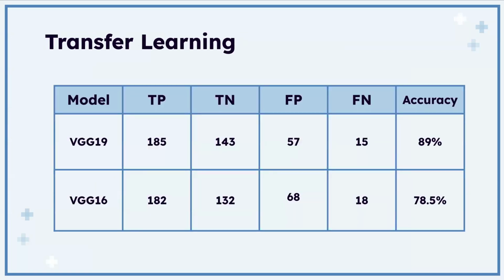So now looking at the table of results, our best performing model was VGG19. It had a strong balance of catching the most pneumonia cases and not flagging too many healthy people. It also had a relatively low false negative, which is really important in medicine. And VGG16 performed decently too, just a little less accurate than the other three, but still performing better than CNN networks and dense.